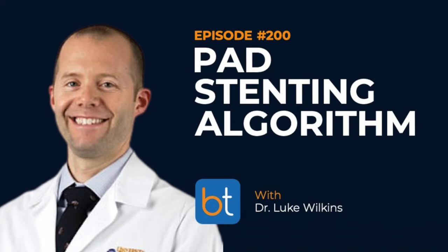I very much encourage everyone listening to take this advice with a grain of salt. You have to develop your own algorithm that's based on a variety of factors: where you practice, how your referring docs approach treatment of peripheral arterial disease, and if they believe in stenting or atherectomy, et cetera. So it's very much going to be site and practitioner specific. That being said, for me, 10 centimeters, I have found that lesions greater than 10 centimeters don't respond to atherectomy as well, and they tend to have an increased risk of distal embolization with atherectomy once you get into those longer lesion lengths.